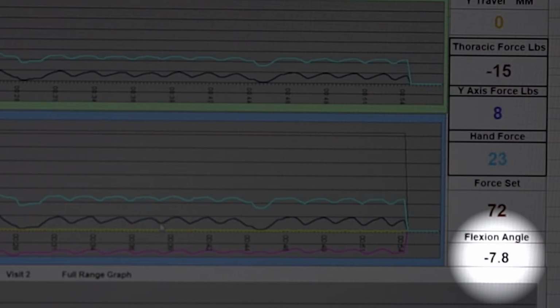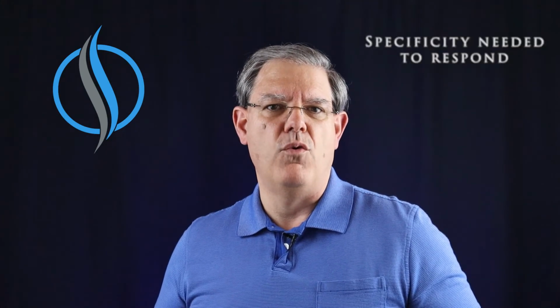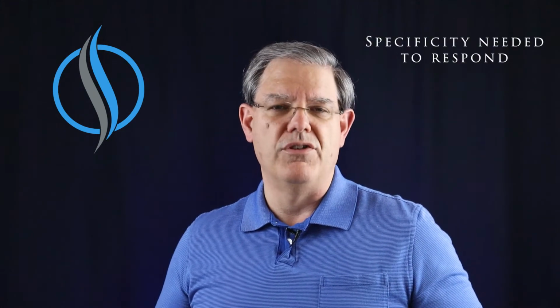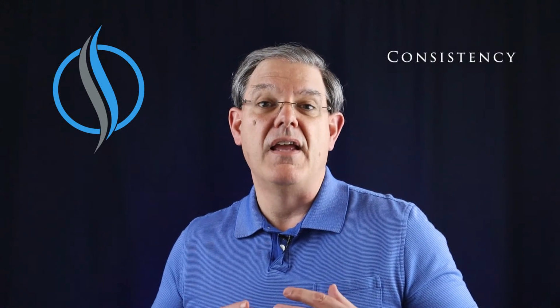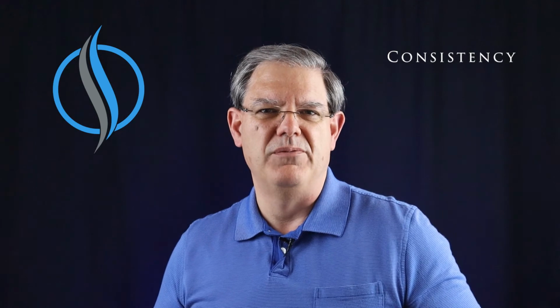Why is this important? There are three main reasons I will use the sensory features of this instrument. The first reason is we find some patients require a very specific amount of force and motion in order to achieve a good response. Like Goldilocks and the Three Bears, you have to find the amount of pressure that is just right for them or they don't get better. When you find that force and degree of motion, you want to be able to repeat it consistently and make every visit as beneficial as possible.